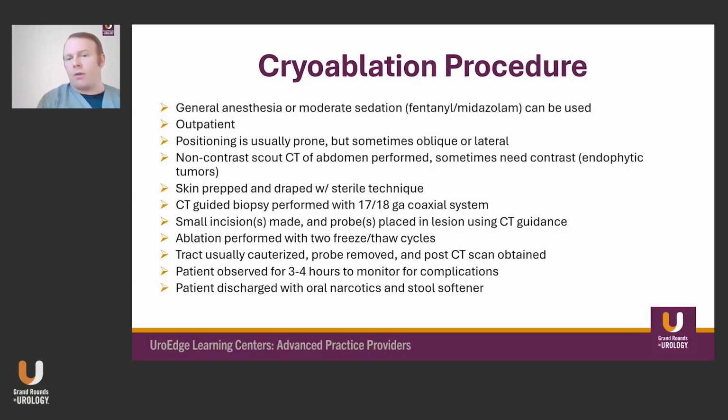So occasionally we'll give 70 to 100 milliliters of iodinated contrast and then get a 70-second regular delay phase, and that usually makes the lesion pop. The contrast is also nice because it is excreted through the kidneys, as you guys know, and so it stays around for 20 to 30 minutes. So you can kind of see how your cryoablation is going as the tumor is being frozen.